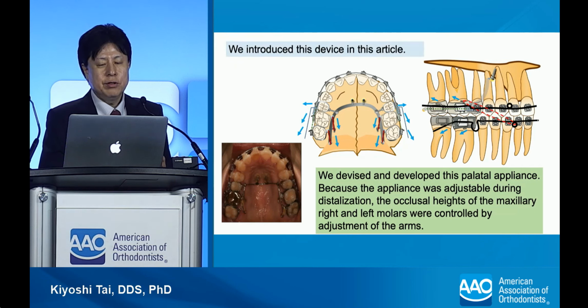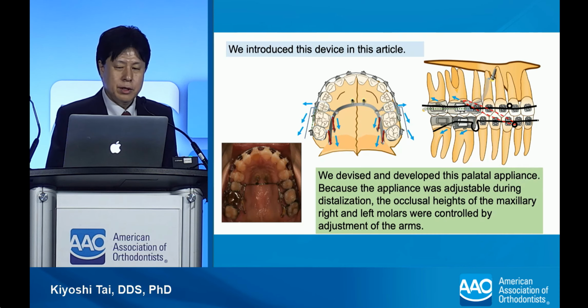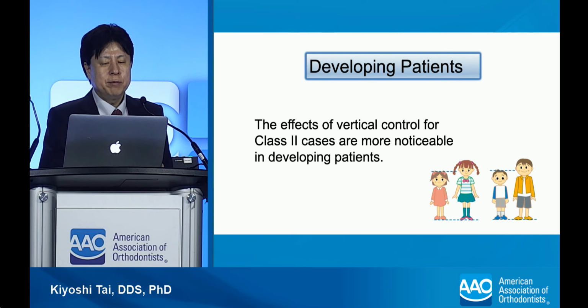We introduced this device in this article. This is a simple and effective design. It is good for correcting the open bite as well as vertical control. The effect of the vertical control for class 2 cases is more noticeable in developing patients.